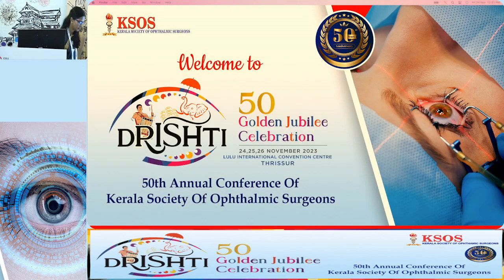Thank you, Dr. Saritha, for your elaborate but basic talk on how to do a gonioscopy. Because gonioscopy is critical in the diagnosis of all forms of glaucomas, which will give information about the increased intraocular tension, and also it is critical to see the potential causes, for determination of therapy. So for therapy as well as the cause of increased IOP, you can find out by gonioscopy. So all general ophthalmologists should know how to do a gonioscopy.